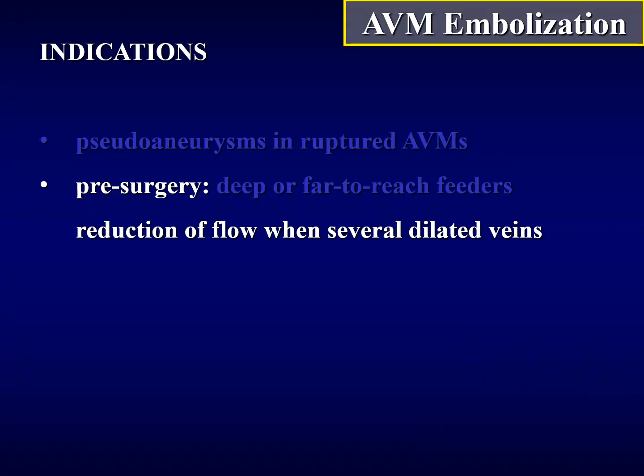In those AVMs where there are many dilated veins, one of the risks of surgery is to have a post-op venous thrombosis. So it may be an advantage to have an embolization beforehand in order to diminish the flow and to diminish the number and the size of the dilated veins.